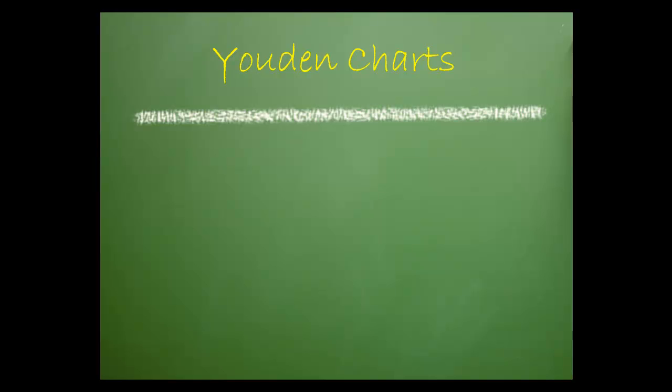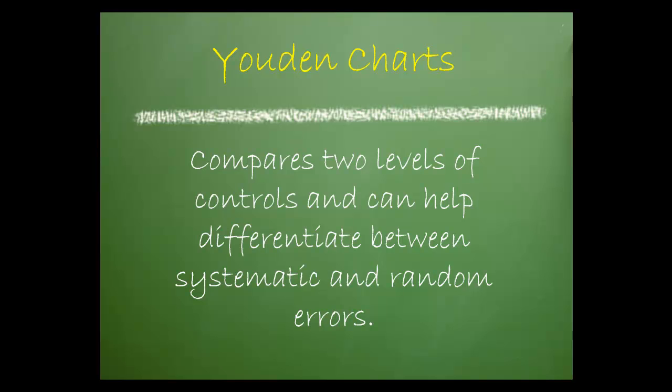Youden Charts were developed in the 1950s by Dr. William Youden. The chart allows the user to compare two levels of controls and can help differentiate between systematic and random error.